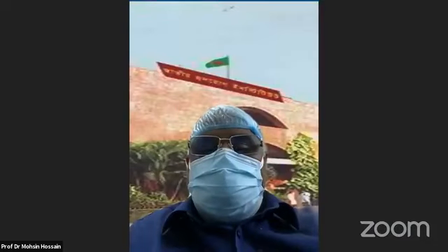Same to me. But Dr. Nesar and I think most of them used to do the pocket first. Dada, are you using diathermy or without diathermy? No, I never use diathermy.